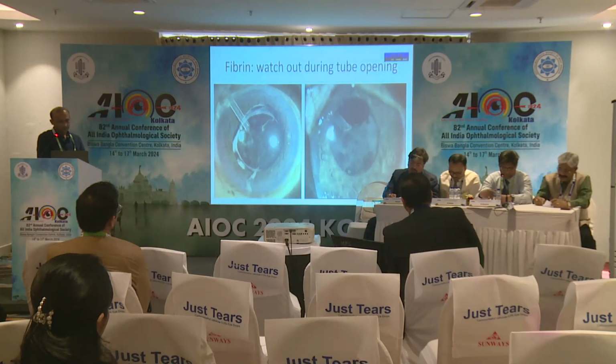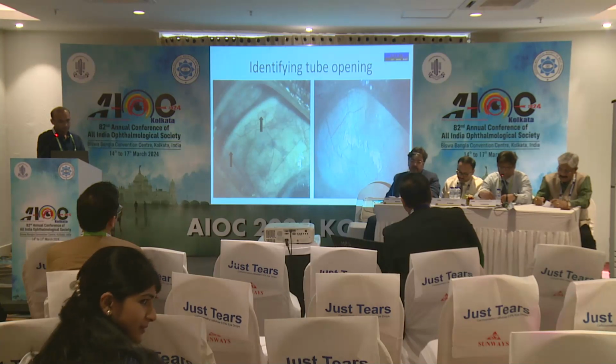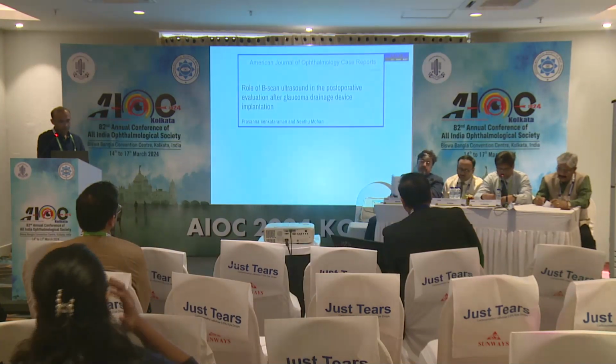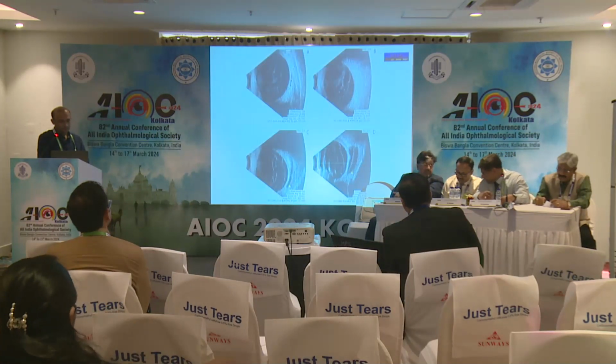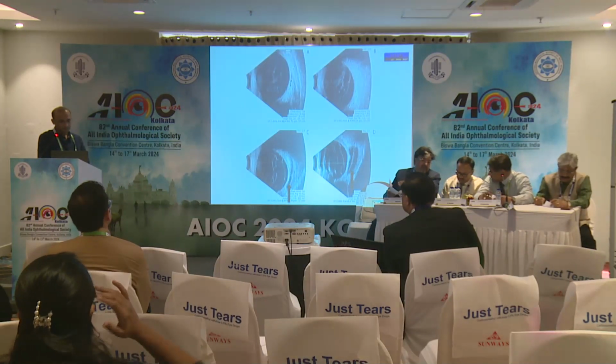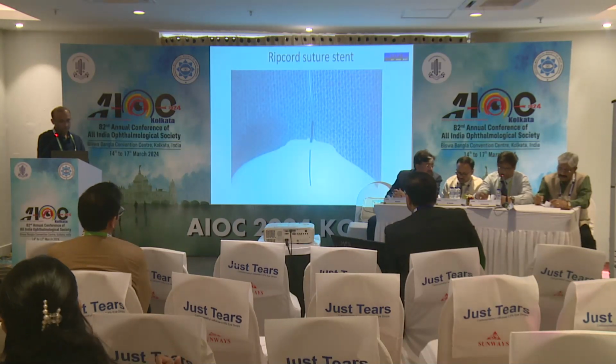Obliteration of the ridge of the implant is an important sign of tube opening and must be looked for at all visits. Serial follow-up B scans will also help to identify the fluid-filled cavity around the GDD end plate. Ripcord suture stent is a technique to avoid precipitous IOP drops during tube opening.